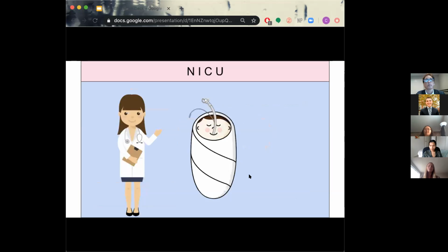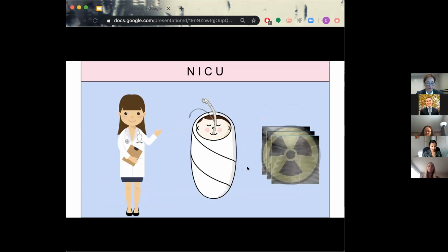Thus, Dr. Foster must monitor the placement of Sammy's endotracheal tube very closely. She does this using daily chest x-rays to see if the tube has moved. While accurate, Dr. Foster doesn't like this method because it's time-consuming and exposes Sammy to excessive doses of harmful radiation. In addition to these shortcomings, x-rays also lack real-time feedback on tube position.